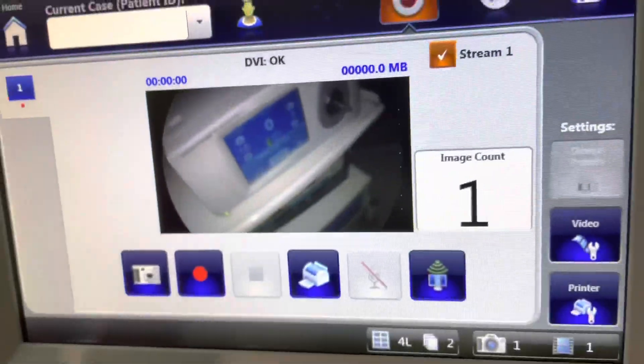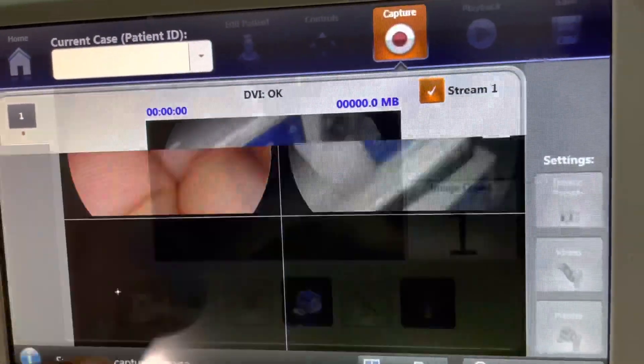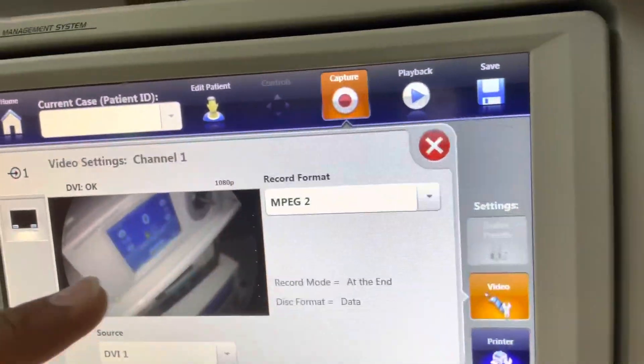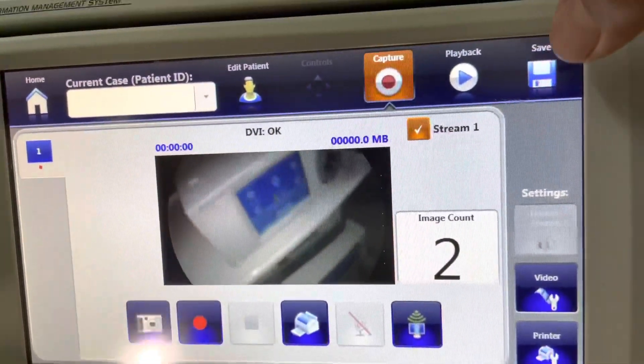You can also view your captured images and videos. As you can see, I captured some images and I can review them as well. You can review all content after surgery.